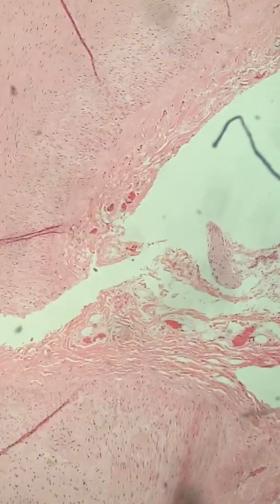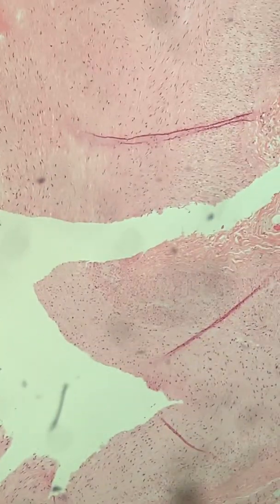I usually take a section of the left coronary artery and the right coronary artery. So here's the second artery, a little collapsed here. But you can see here too, here's the lumen, and there's not much in the way of significant atheromatous change. There's some mild atheromatous change, but not that major. As you can see, the vessels are very widely patent. So I'm going to go to the next slide, which would be a section of the liver.